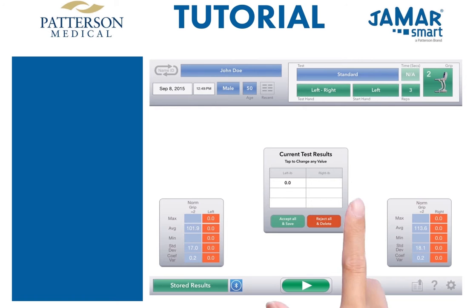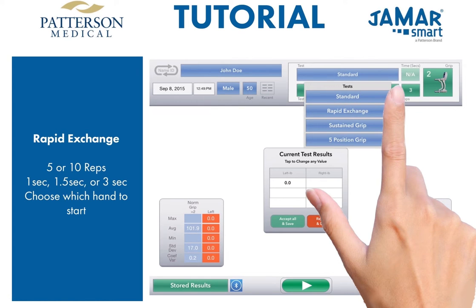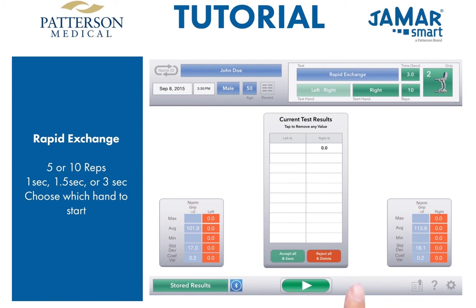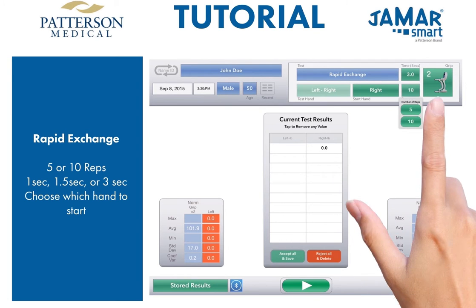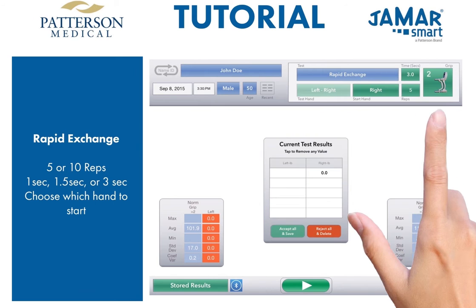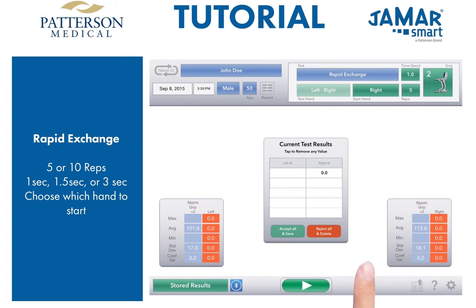Now let's do the rapid exchange test. With the JMR Smart app, the data will be automatically collected and stored — no need to write test results, no more administrative errors. We can quickly change the number of reps and start hand. Then we can choose between 1 second, 1.5 seconds, and 3 seconds for the time between each trial.